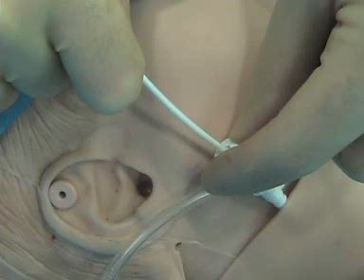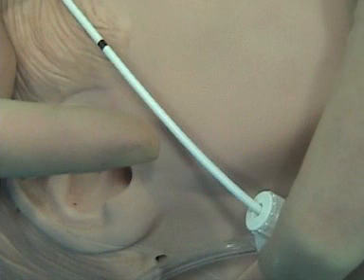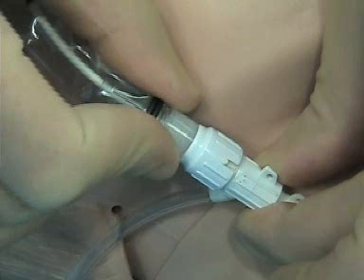Put the Swan into the introducer. Get to 20 cm — each mark is 10, so two marks means 20. At that point, inflate the balloon and advance. Once the balloon is inflated, go in until you get into the PA. Ideally you'll get there before 50 cm — certainly do not go past 50 unless the patient really has a big heart. Around 45 or so, just leave it there. Once you've got it, slide the sheath down and hook it into the gizmo, so the Swan is protected and sterility is assured.